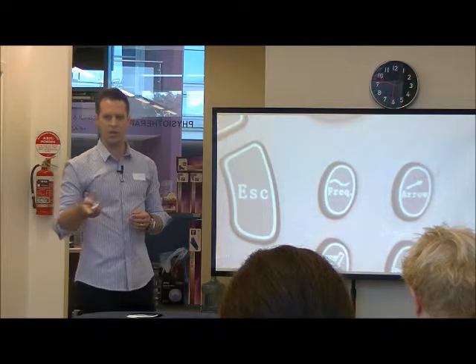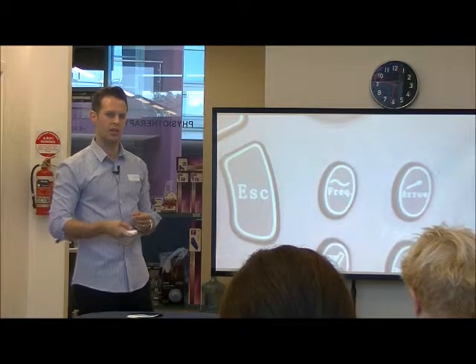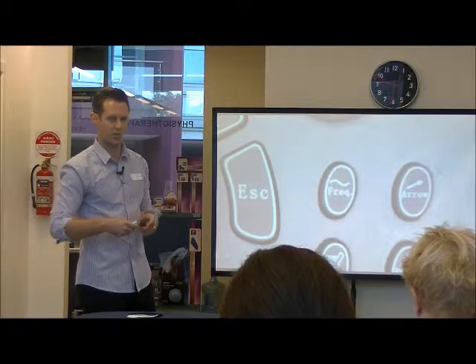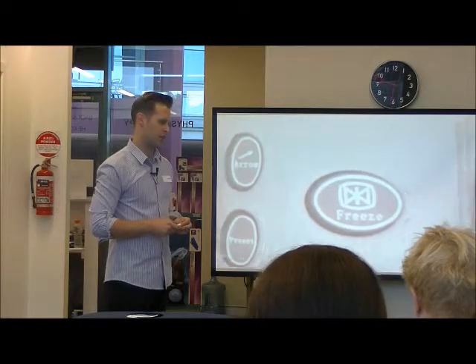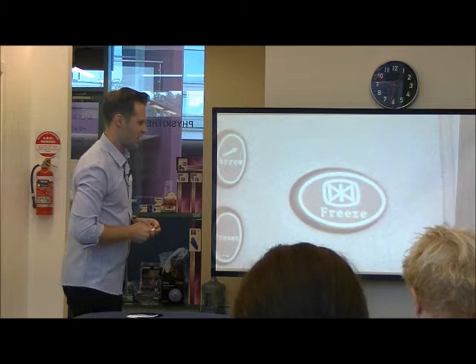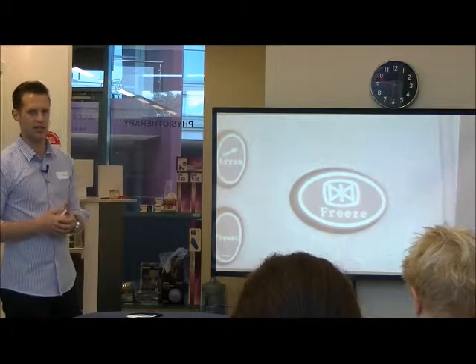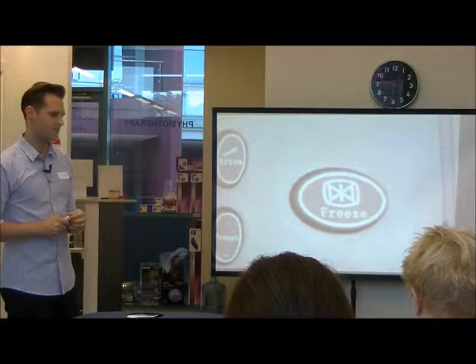If, however, you turn down the frequency so that you're getting a stronger image or a deeper penetration, if you like, you may miss out on a little bit of definition. So ideally, you want to have the highest frequency you can and still be able to visualise the structure.